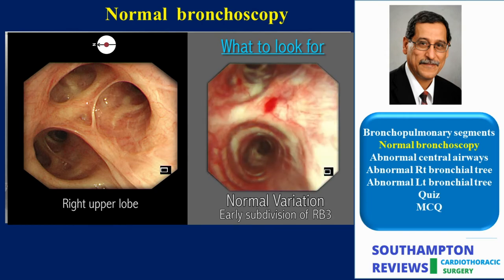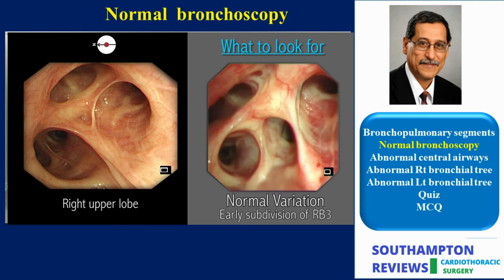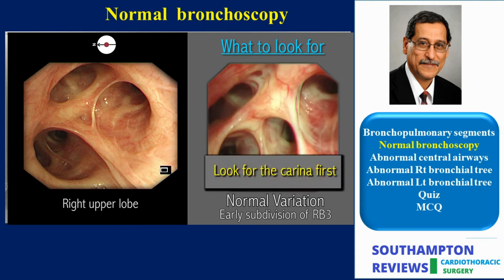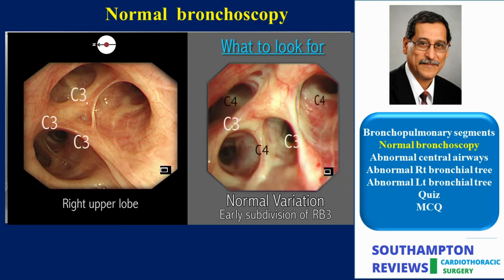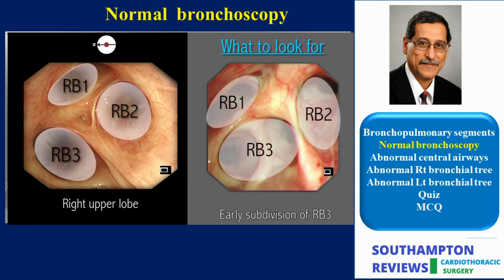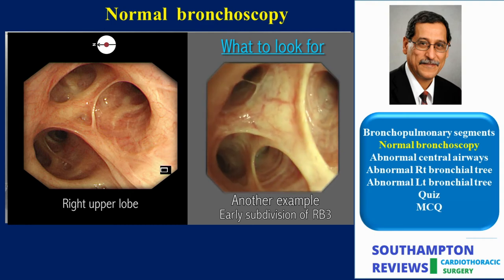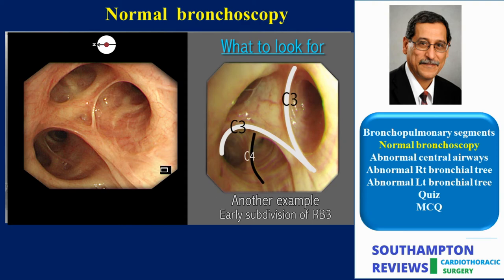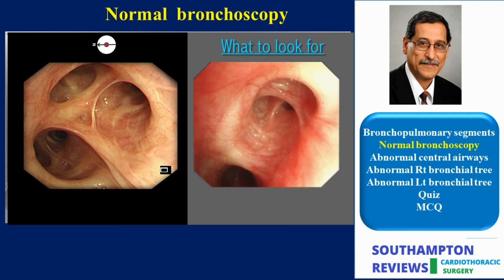Remember, this is the third level of division. A common variant of the normal is four divisions instead of three — the anterior segment bronchus divides early into two subsegmental bronchi, giving the impression of four divisions. If we follow the rule of seeing the carinae first, it becomes clear which carina is C3 and which one is C4. Another common variant is two divisions soon branching into three bronchi; in the example shown, the anterior and posterior segments share a common orifice. Identification of these abnormal orifices can be confusing and I usually go back to scrutinize the CT scan to tally with the bronchoscopic findings.